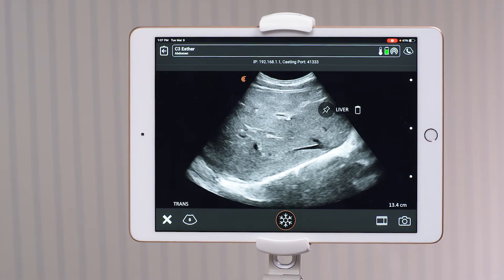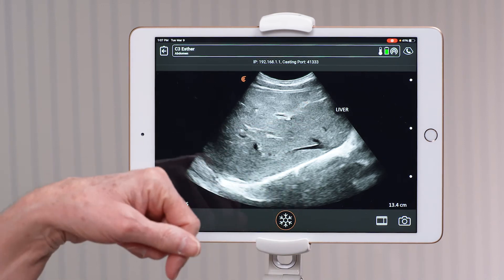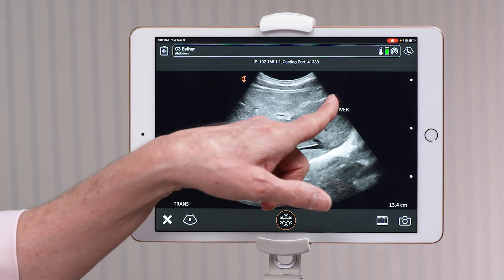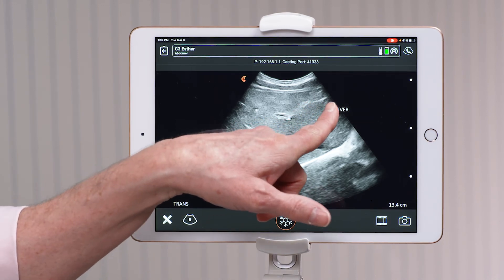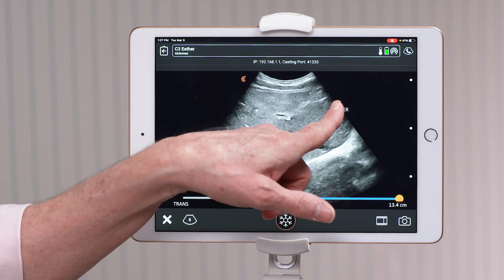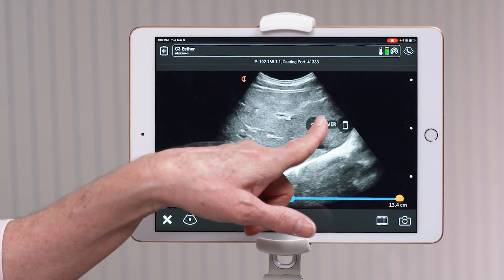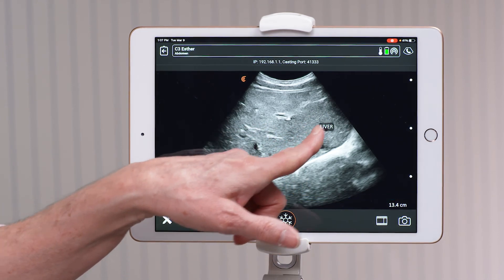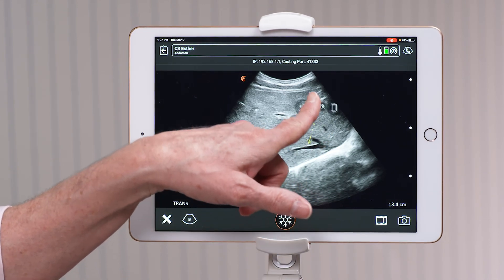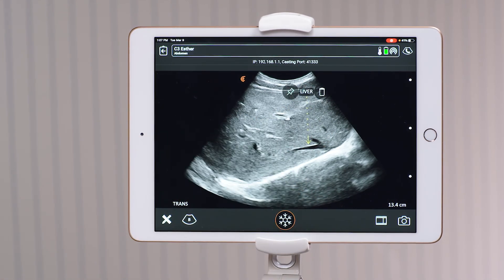You can also point to an area of interest for the referring physician to take note of. You do that by tapping the pen and pointing to the area that you want them to be aware of.